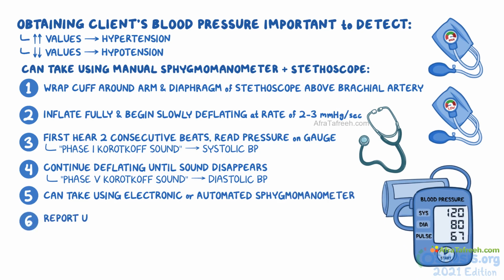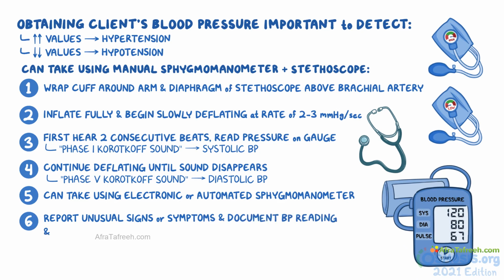Remember to report any unusual signs or symptoms to the nurse, and document the blood pressure reading and the method it was taken along with your observations.